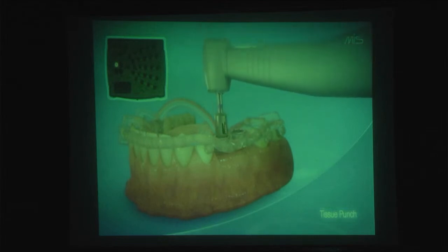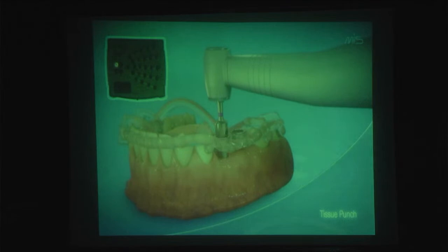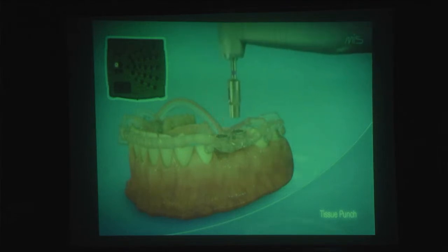And it must touch the tooth surface entirely. This is the punch-out excision for 25 RPMs with irrigation. 1 and 2.